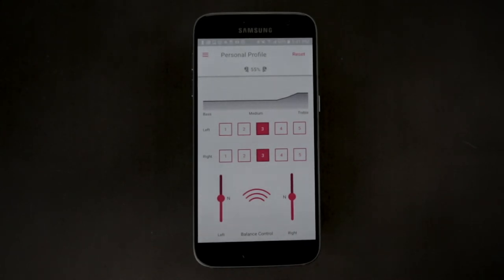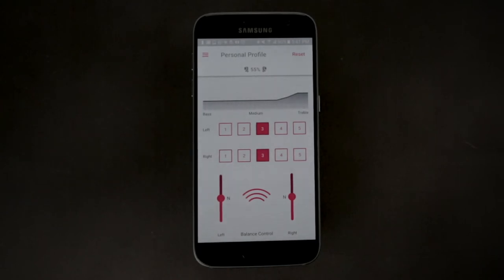Once completed, the settings are saved in the IQbuds and should not have to be adjusted again.